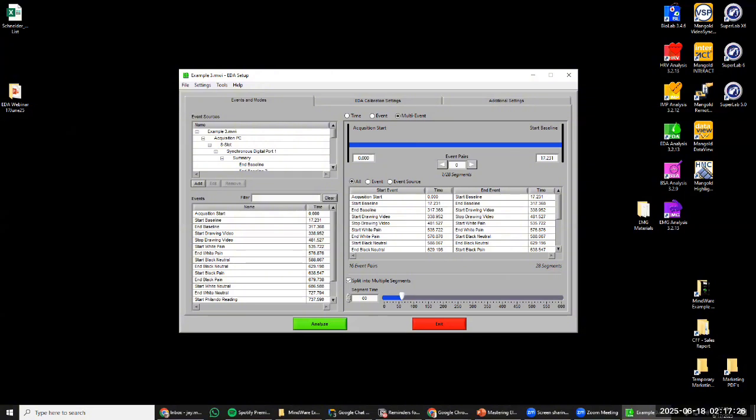Yeah, so there's a question here about whether we're able to use skin conductance responses, both event-related and non-specific, on segments of varying lengths, between 20 and 60 seconds on a single subject. So yes, you could definitely do this. After that, though, we do need to consider the amount of time allowed for your SCRs to occur here. What we don't want to do is let our windows overlap on each other, so we're using the same data twice, if you will. So as long as we're controlling for that, such as there's 20 seconds that occur here and a separate 60 seconds that occur afterwards, that's fine. But we don't want to be sharing the same time and data.